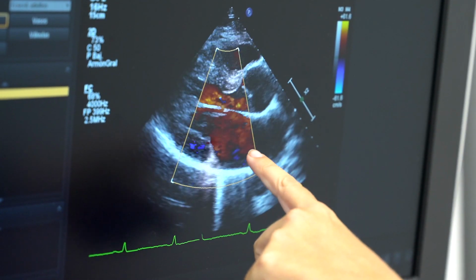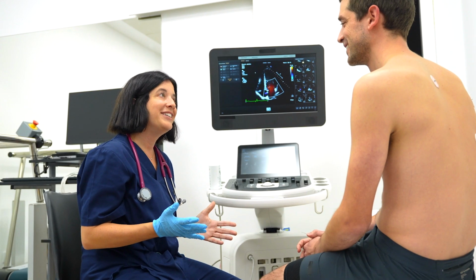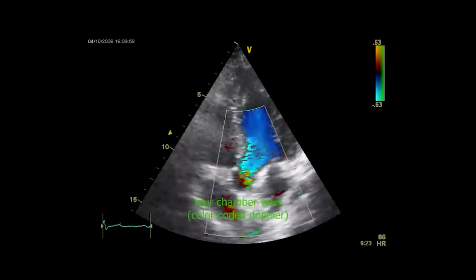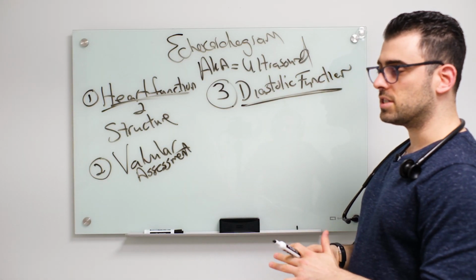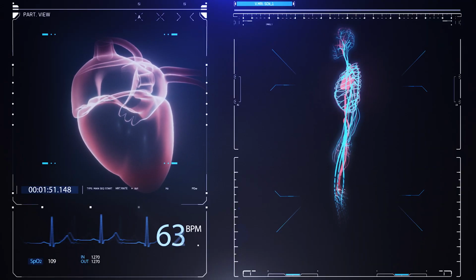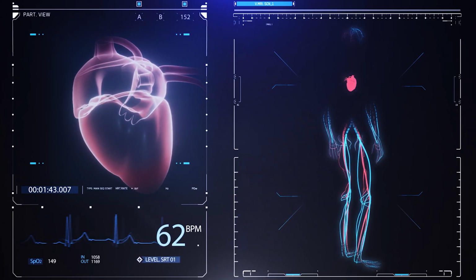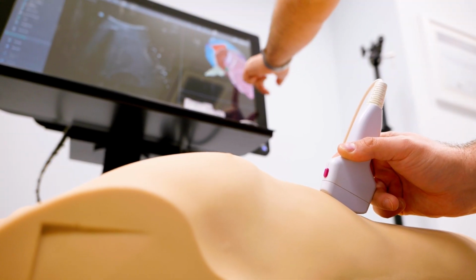An echocardiogram, in summary, is an ultrasound test that uses both visual and Doppler, or sound, assessment of the heart to be able to see how the valves look, how the heart squeezes, how it relaxes. There are a few other intricacies that we do from time to time based on the clinical setting. So if we need to use 3-dimensional imaging, or different types of M-mode or more time-specific imaging.